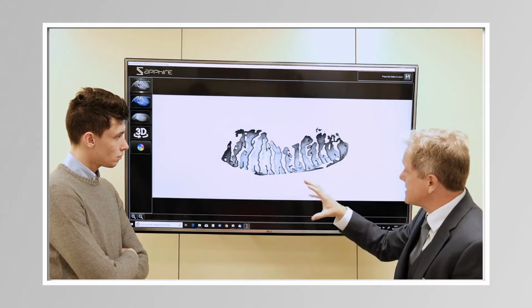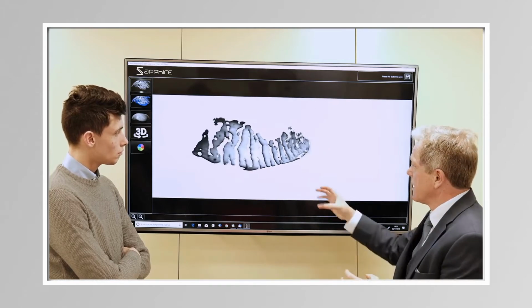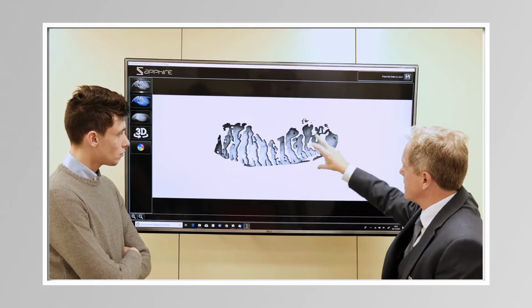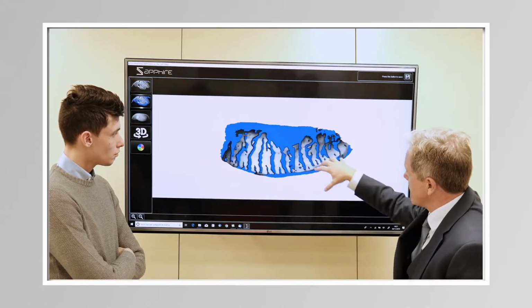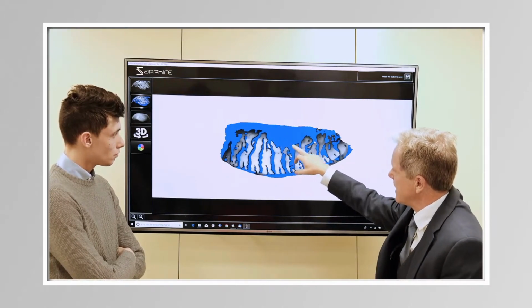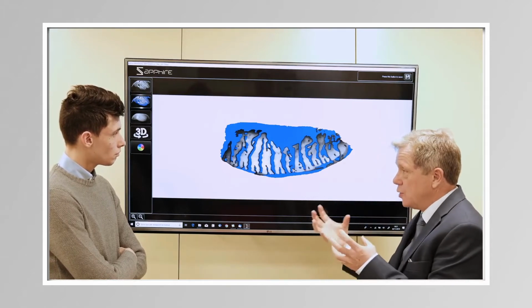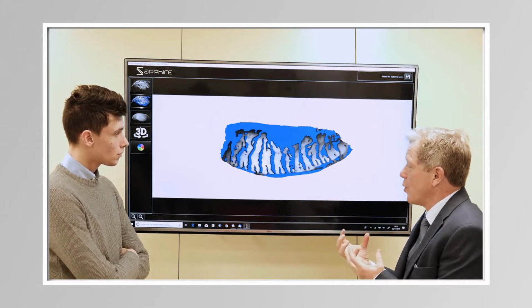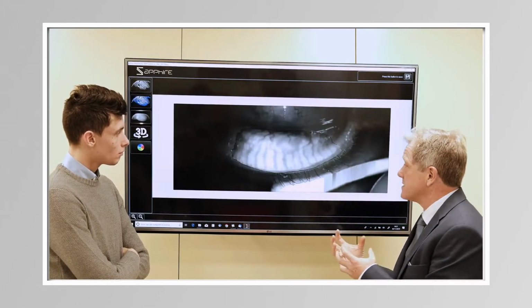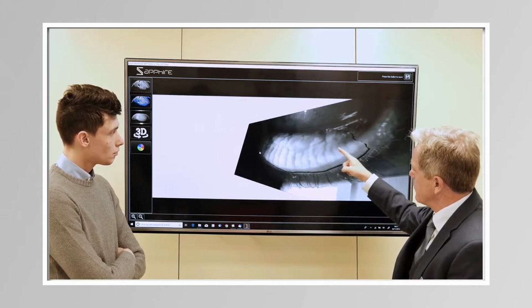So Mario, this is the glands in the lower lids that produce the oils. We can see that the glands have really nice flow of the glands here. We have potentially a loss of the glands over this area. If you lose those glands, you're not going to produce the quantity or quality of the lipids, the oils that need to stabilize the tear. Let's have a look at this in more detail.